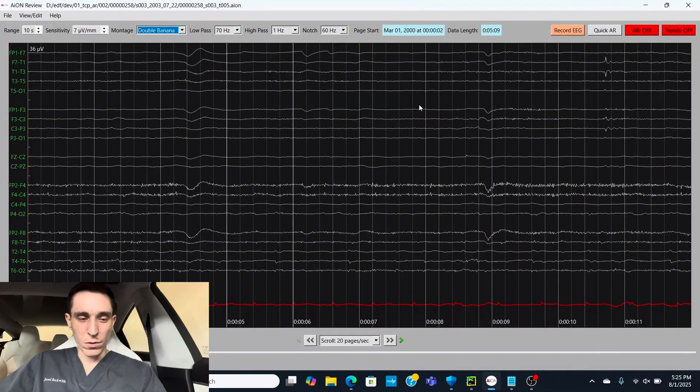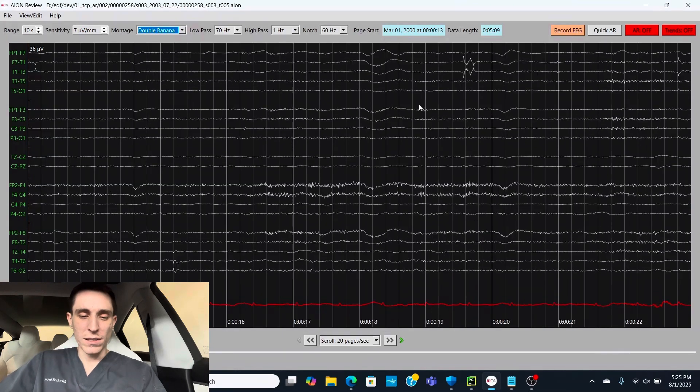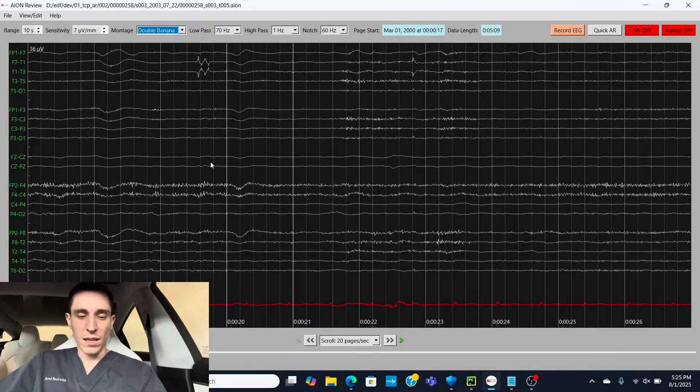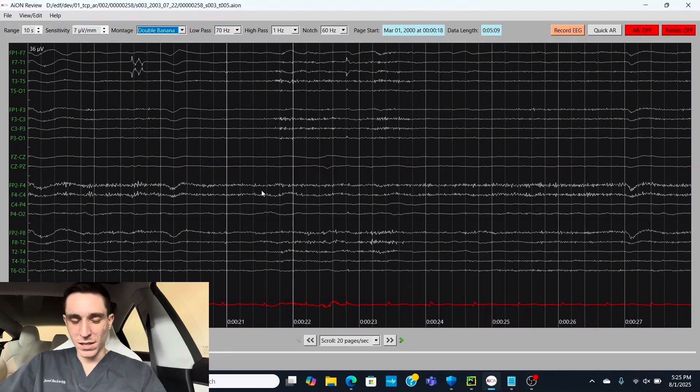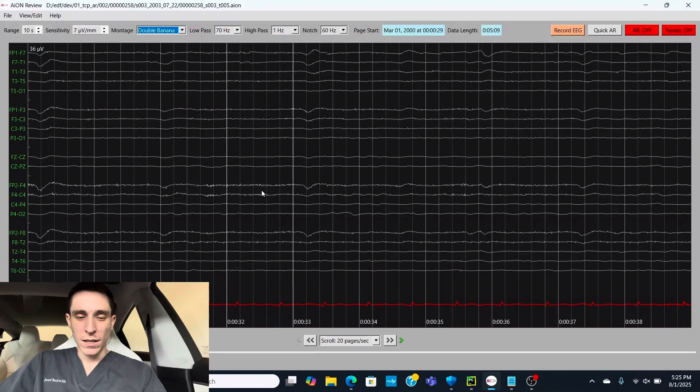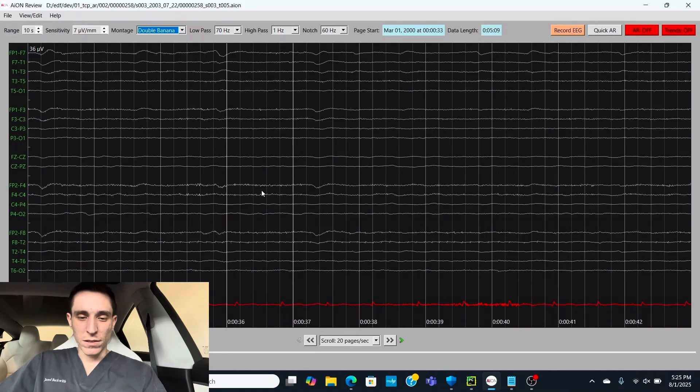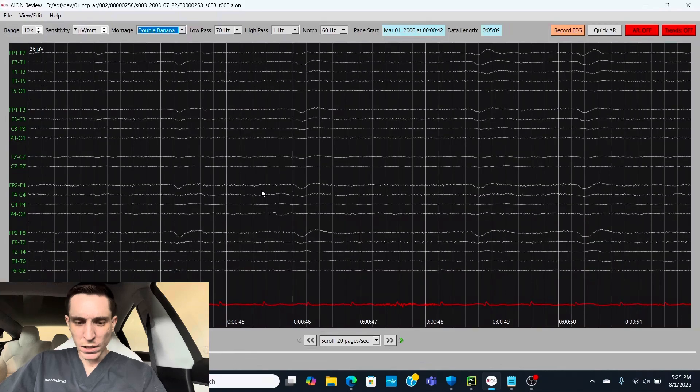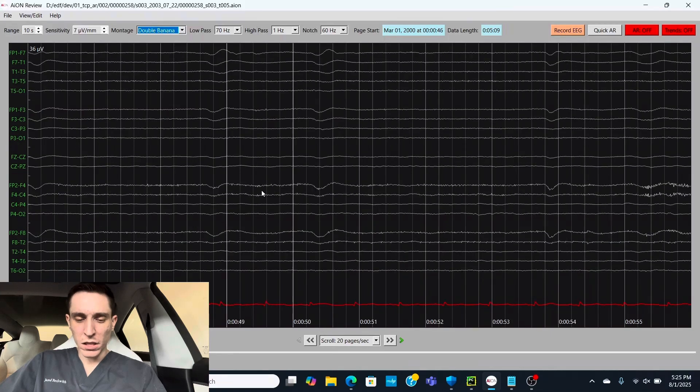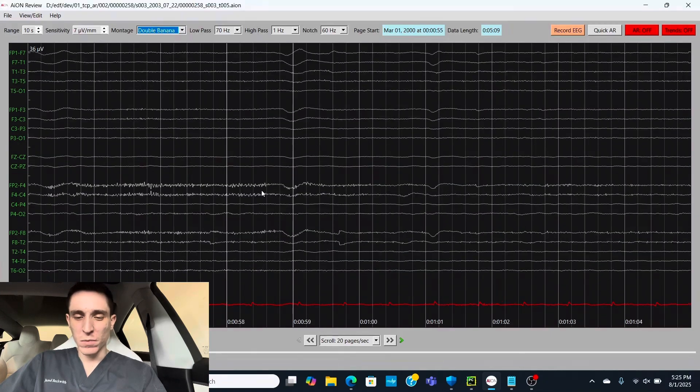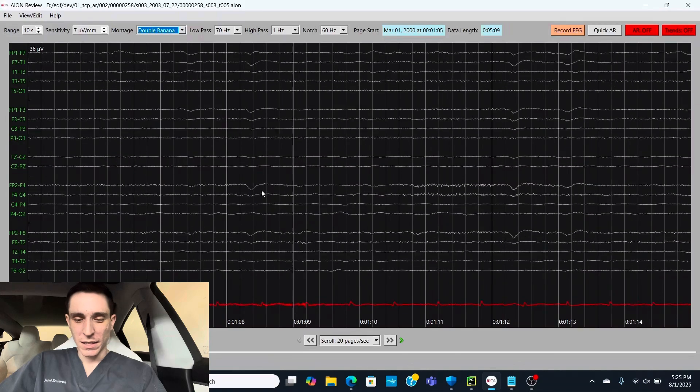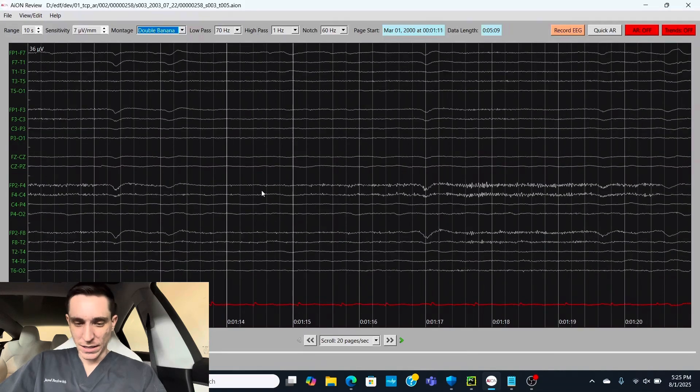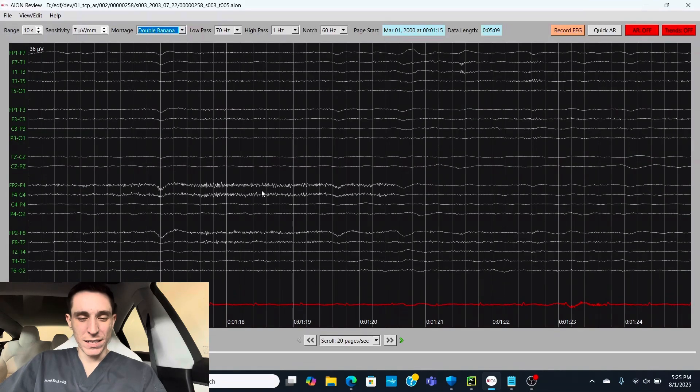Now, scrolling through this EEG, we can see a little bit of muscle tension here, probably in the forehead. And we've got some really low amplitude slowing in this patient. And I haven't seen any epileptic activity yet.